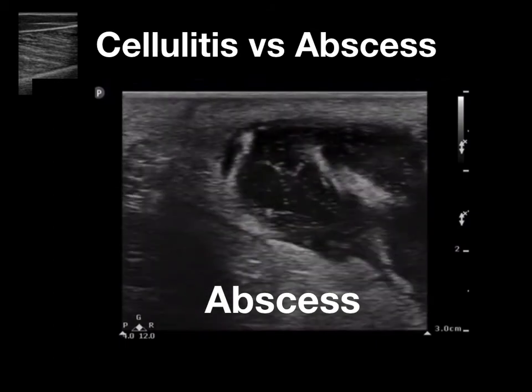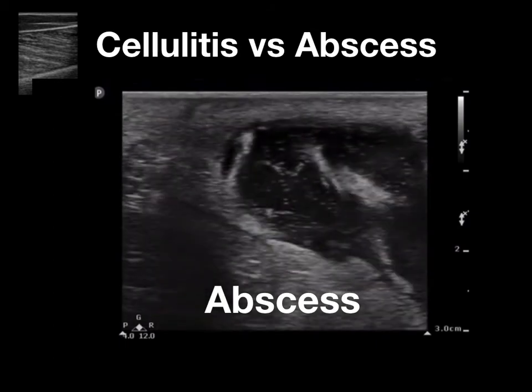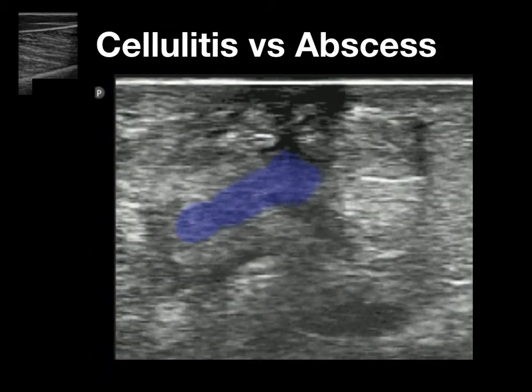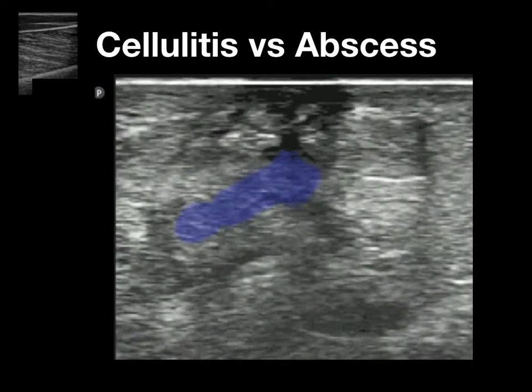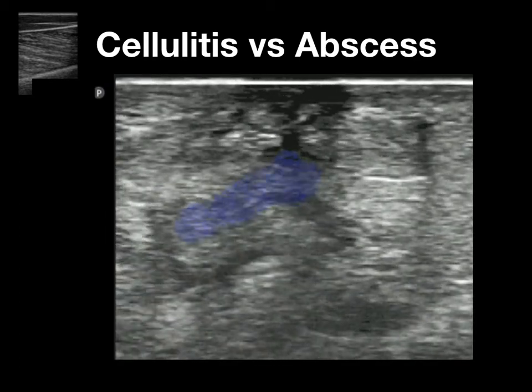One pitfall I often encounter is mistaking an abscess for a soft tissue infection. Often fluid in the abscess can become very hyperechoic and make it difficult to see. That's where the swirl sign comes into play again. Notice in this soft tissue ultrasound, if you didn't compress, you wouldn't appreciate that there's fluid there.